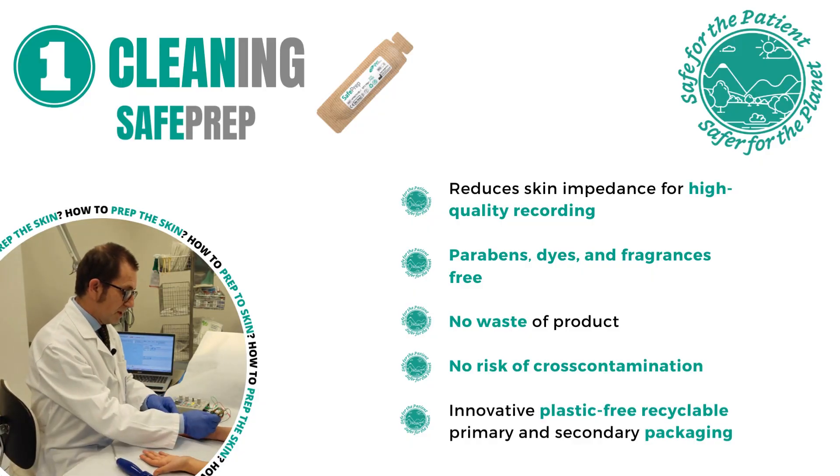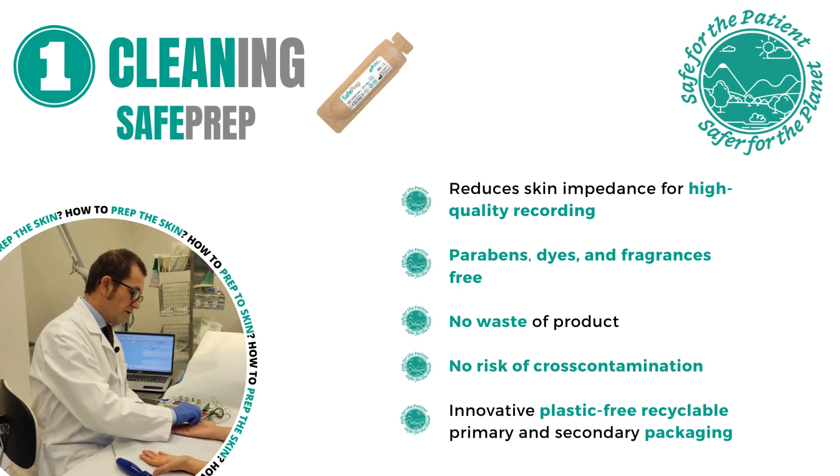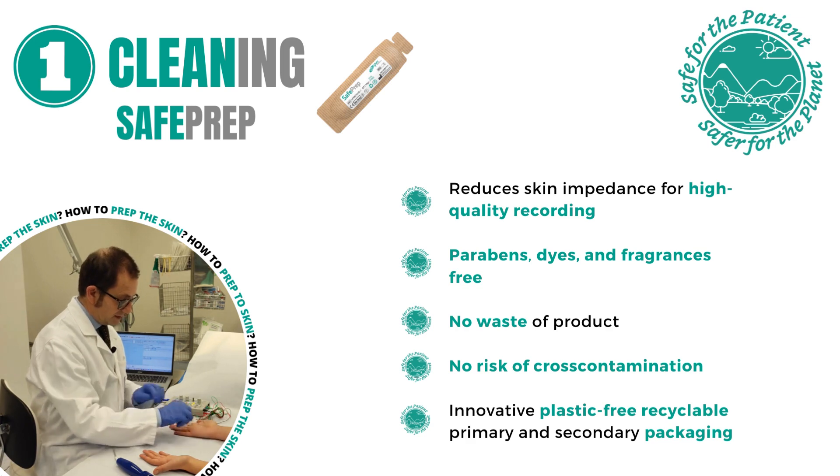To clean the skin, we put a small amount of gel on the skin and we brush to improve the contact between the electrode and the skin.